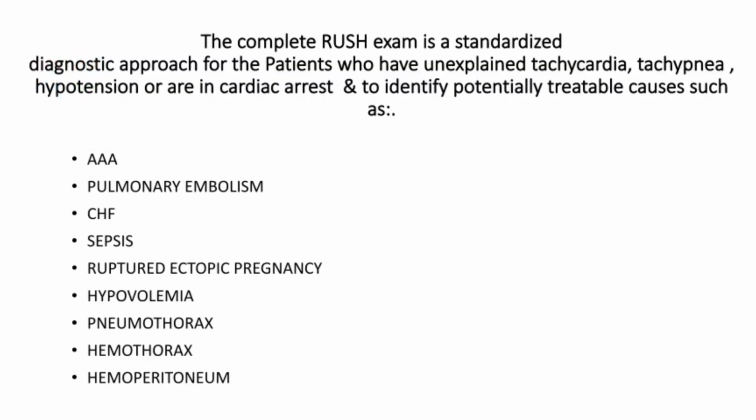Today I will be dealing with rapid ultrasonography for shock and hypotension, commonly known as the RUSH protocol. What's the RUSH protocol? It's a complete RUSH examination, a standardized diagnostic approach for patients who have unexplained tachycardia, tachypnea or hypotension, or are in complete cardiac arrest, and to identify any potentially treatable causes, such as abdominal aortic aneurysm, pulmonary embolism, congestive heart failure, sepsis, ruptured ectopic pregnancy, hypovolemia, pneumothorax, hemothorax or hemoperitoneum.